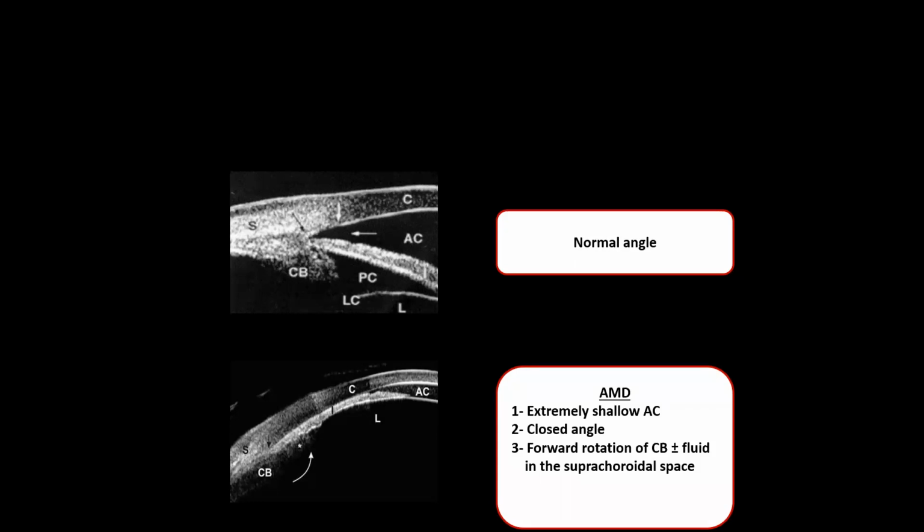I can do a PI for the... I will check if the patient has... So we agreed that there is already a PI. What you will do for the patient now? I can use YAG. Remember, he's pseudophakic, which allows me to use the YAG laser to create a window.